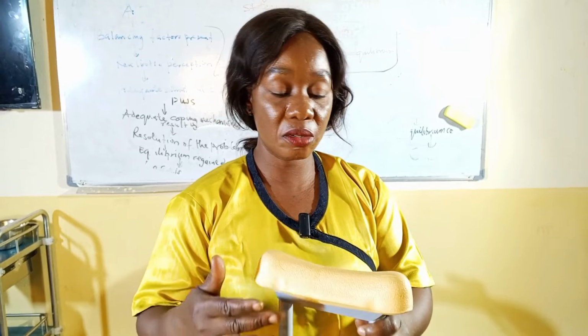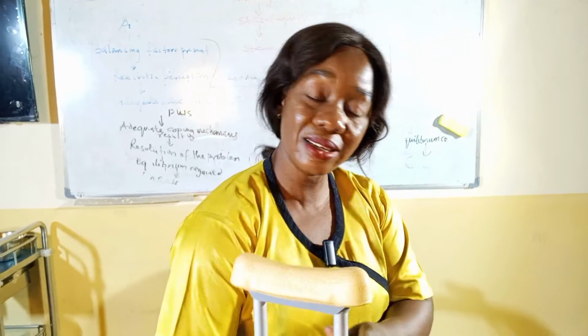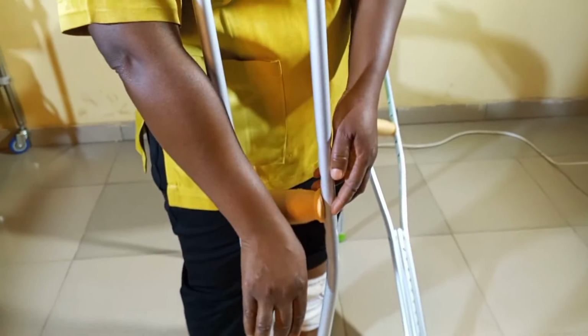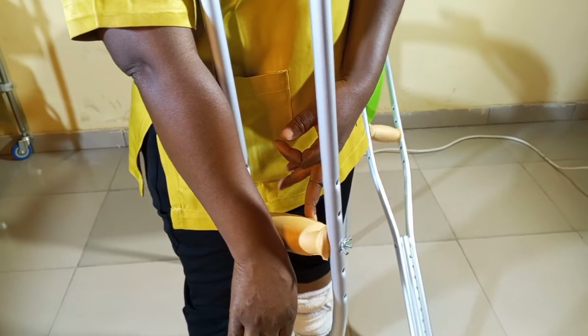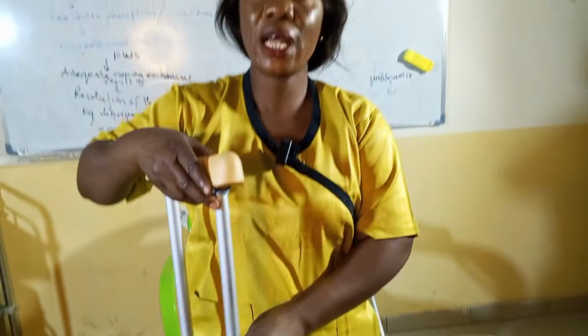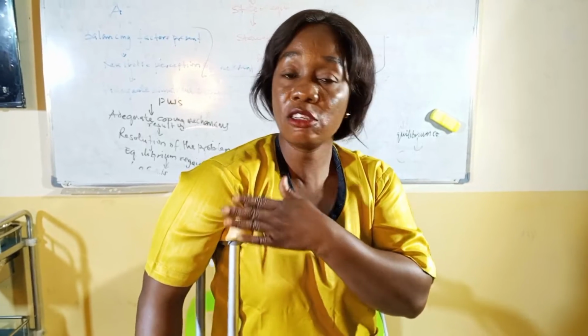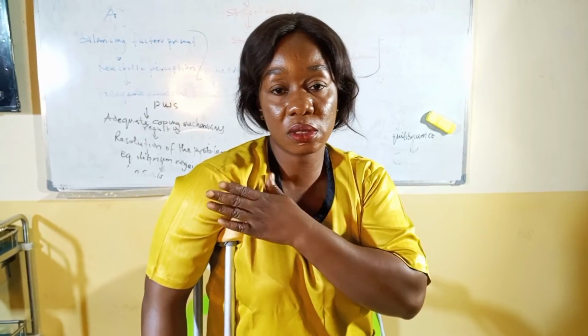Make sure also that when you are adjusting the crutches, the handle, this is the handle, the patient's wrist should be at the same level as the handle. And teach the patient not to lean on the crutches, to avoid applying pressure on the nerves around the axilla. This causes numbness and tingling around that area. So make sure that you adjust it properly and the patient can hold the handle properly.